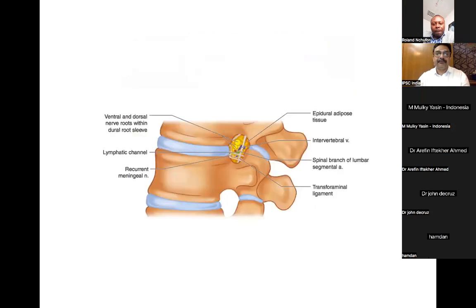Okay. All right. So we already discussed the anatomy of the foramen, and we know this is the area where we have to go because we are talking about a transforaminal endoscopic lumbar discectomy, TLD. So for that, the foramen is important, and we have to reach our target fragment, whether it is inside or outside, or within the foramen, or outside the foramen, whether inside the canal, it is migrated upwards or migrated downwards. Whatever it is, we have to go through this foramen.